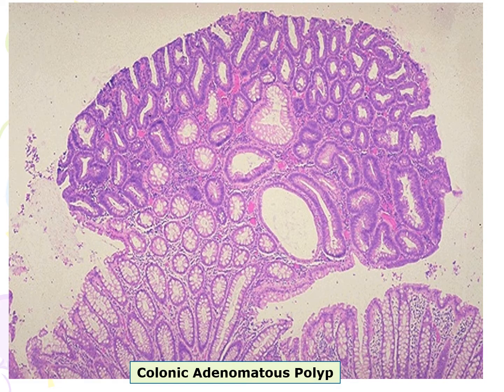This is a small tubular adenomatous polyp on a small stalk, having more crowded and disorganized glands than the normal underlying colonic mucosa. Goblet cells are less numerous, and the cells lining the glands of the polyp have hyperchromatic nuclei. These are the features of dysplasia. However, it's still well differentiated and circumscribed. So this is a polyp of low-grade dysplasia.